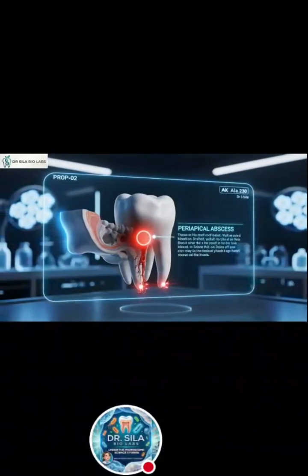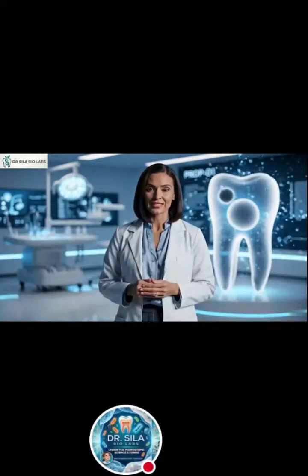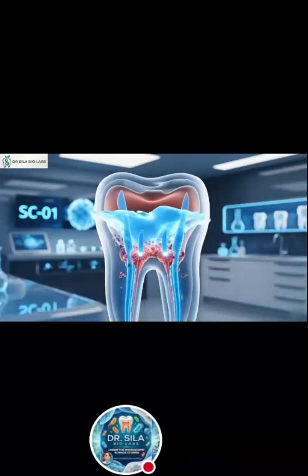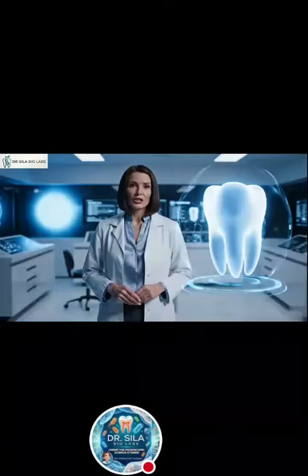We also discovered how this infection can spread. Most importantly, we learned that root canal treatment is designed to save a natural tooth, by carefully removing infected tissue, disinfecting the root canal system, sealing the canals, and restoring the tooth.